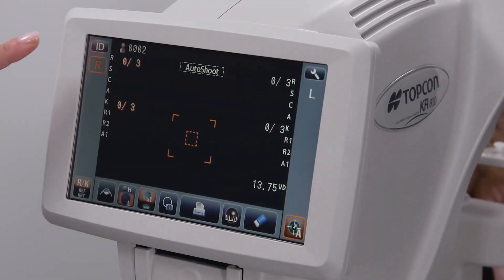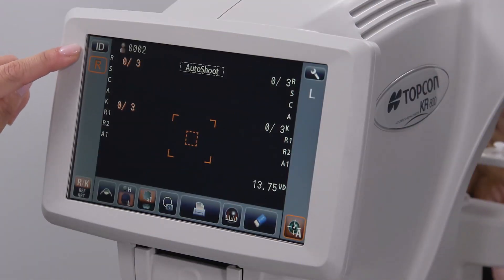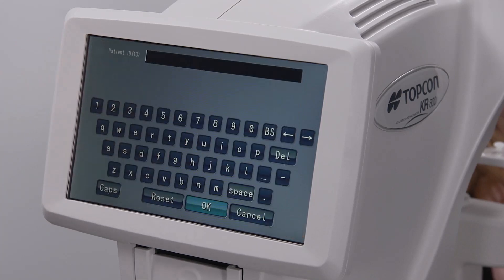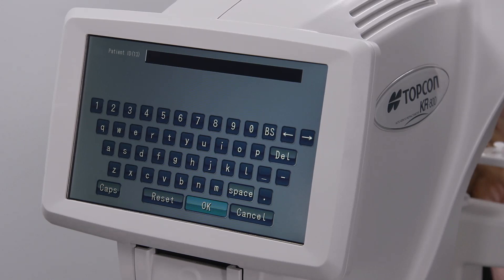At the upper left of the screen is a patient ID icon. By selecting this, you can manually enter identification for the patient; otherwise the device will automatically generate a number.